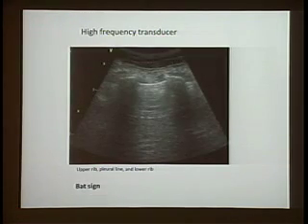Let me see if I can show you again. Well, a little bat is supposed to come here. And you can see the wings of a bat here. This is the body of a bat. I'll show you in the lung. The pleural line is more clear.